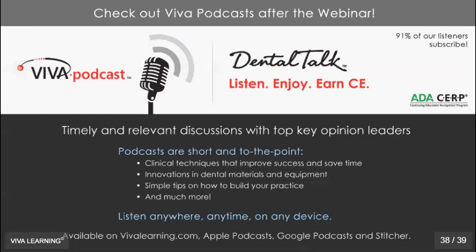Hannah says, is the solution changing frequency listed on the instructions? I have a dentist who only wants to change the solution once a week. Hannah, that's kind of like changing your dishwater. If you were washing dishes by hand at home, it's kind of like changing your dish solution once a week at home. Kind of gross, kind of a bad idea, not a good practice.